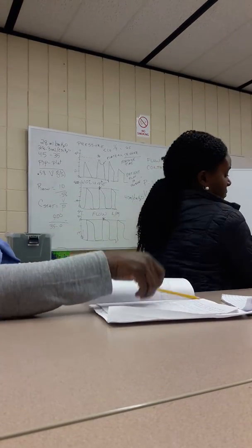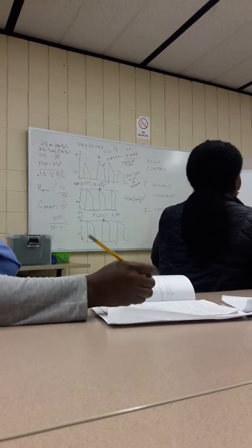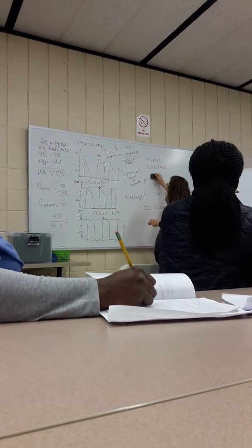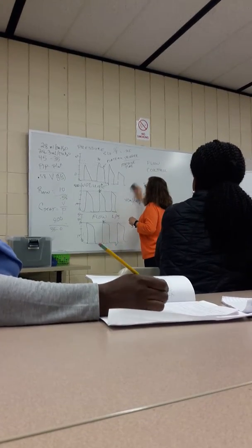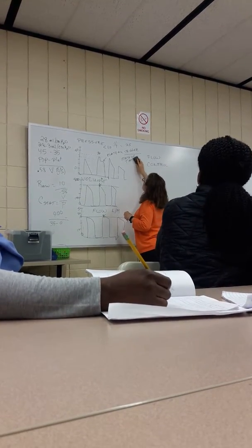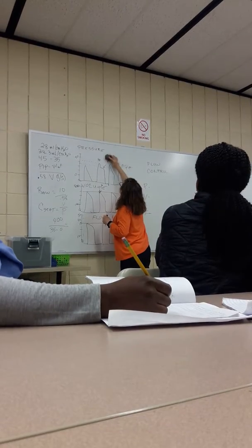Okay, how long is this freaking thing? When it comes to flow control, she doesn't realize how long it's gonna take. I know what the question was about, pressure support and stuff. She doesn't know what it is right now.